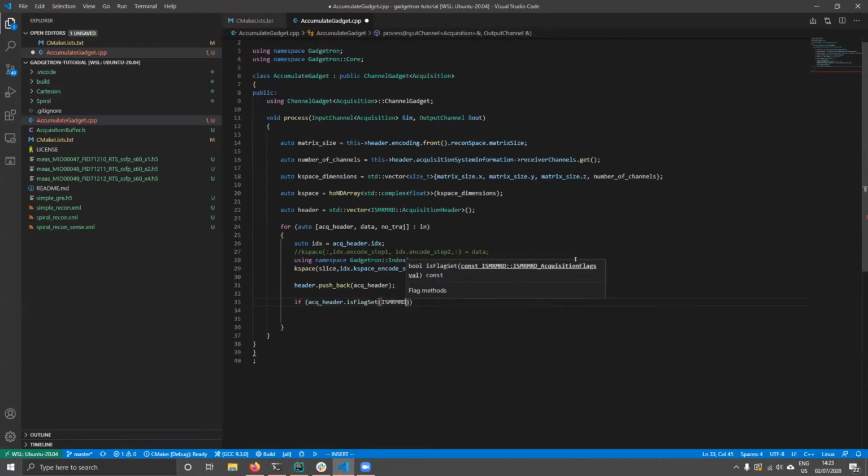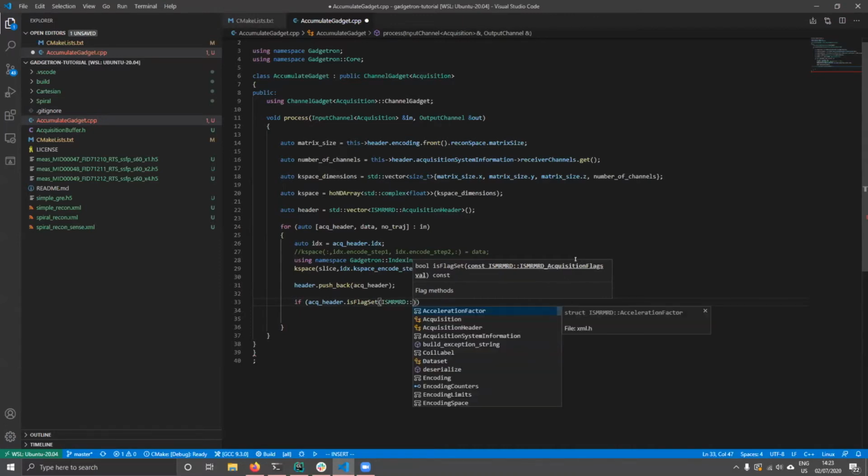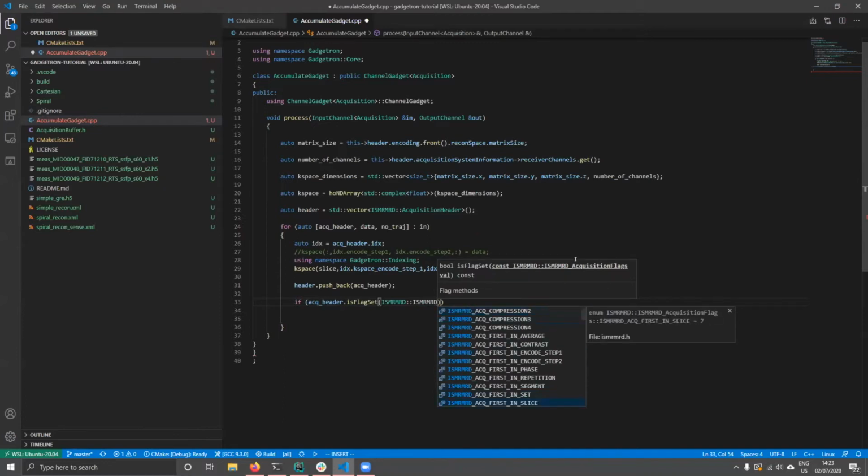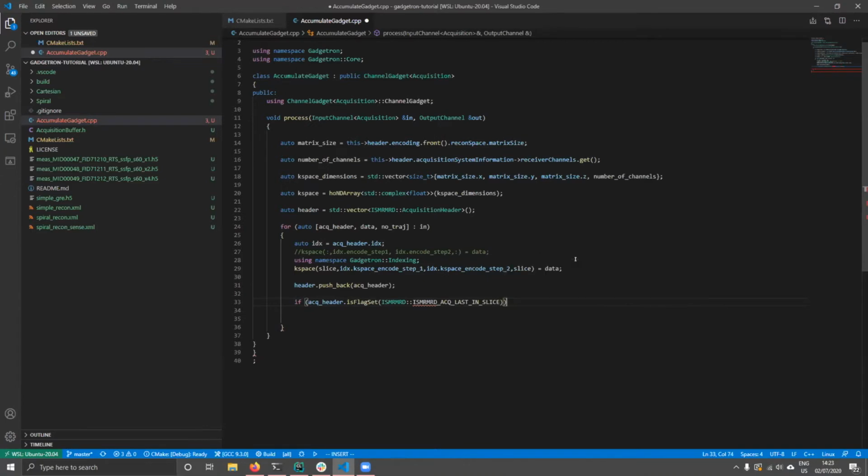So this is a little different from how we normally trigger with the bucket to buffer and accumulate trigger gadget. So typically they trigger when the index changes. We're not going to do that. We're going to instead look at the flags in the acquisition header. And in particular, we want to look at the last in slice flag here. We know it's done. We're ready to send the data on.